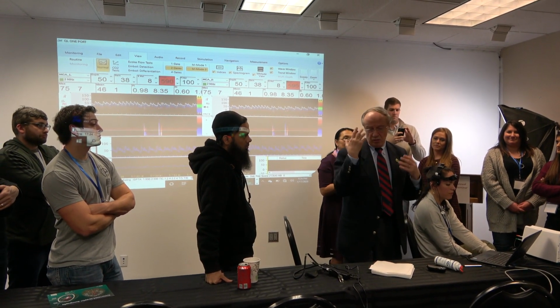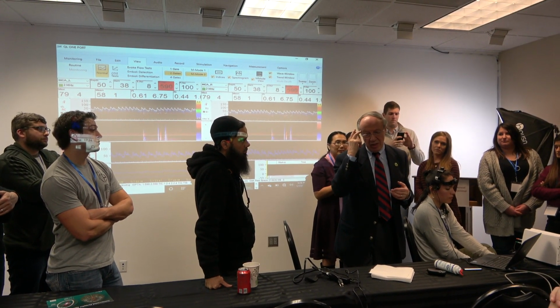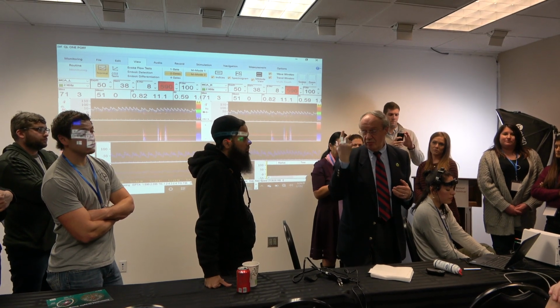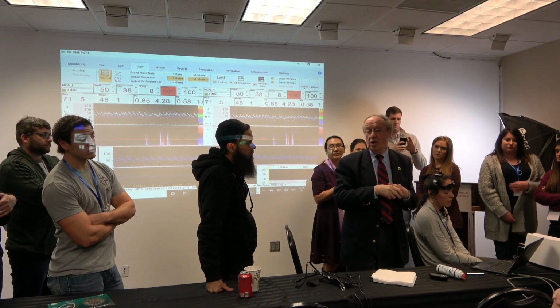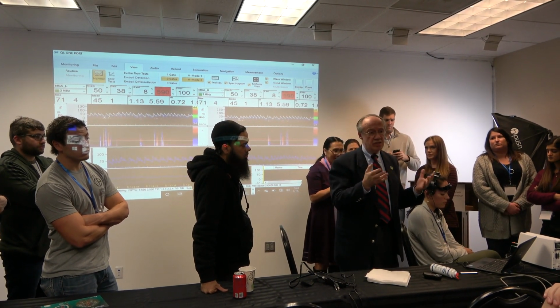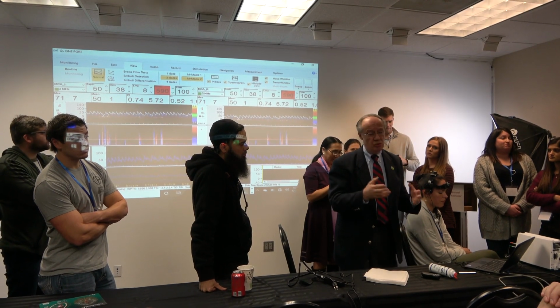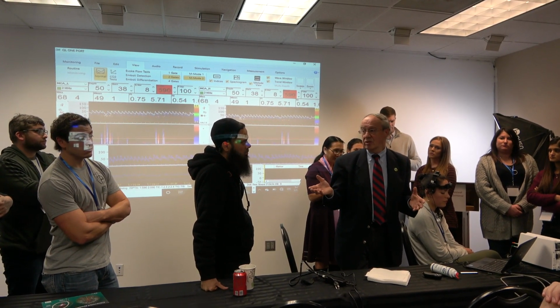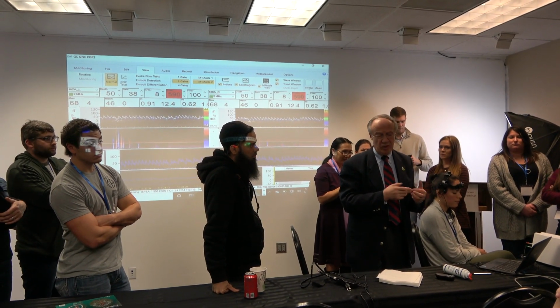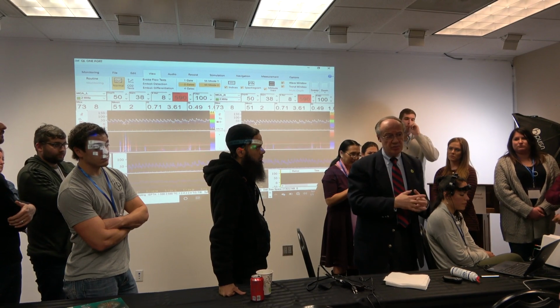We're starting the study on the right side or left side. We are doing M1, M2, C1, A1, then directly probe more posteriorly, and we find PCA, P1, P2. A full complete diagnostic study is around 24 segments in the report format. But not always are you able to find all of them. At least the majority of them, M1, M2, C1, A1, we usually find relatively easily. Of course, basilar artery, vertebrals.